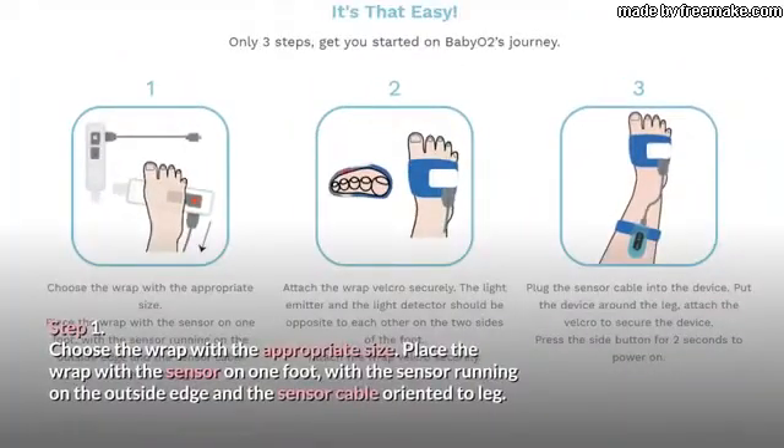With just three steps, get started on Baby O2's journey. Step 1: Choose the wrap with the appropriate size. Place the wrap with the sensor on one foot, with the sensor running on the outside edge and the sensor cable oriented to the leg.